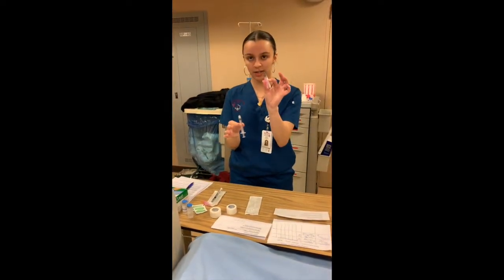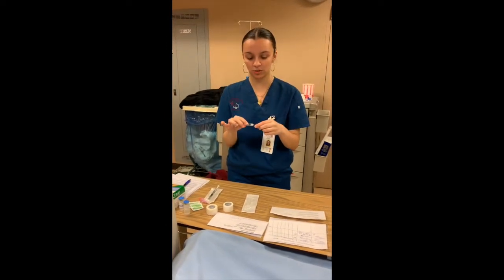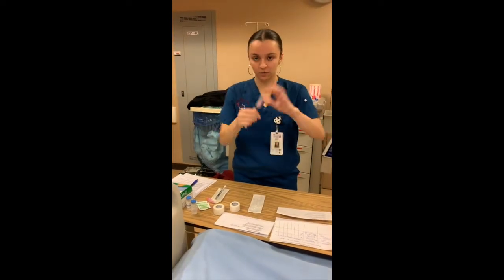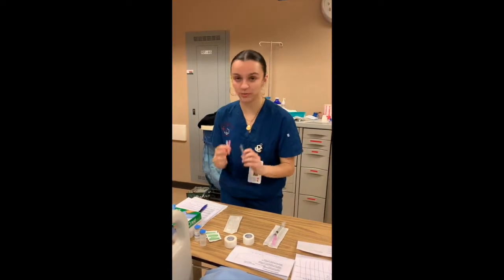Next, you're going to be putting the cap, which has the needle inside, just attaching it to the actual syringe, just to make sure. Give it a nice twist until it's fully on like this. Now I'm just going to prepare the subcutaneous needle.